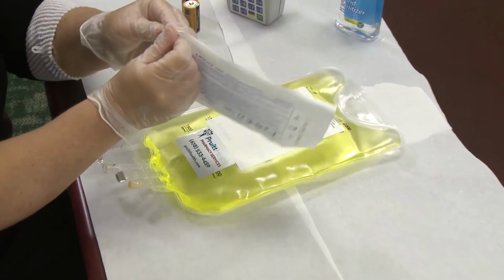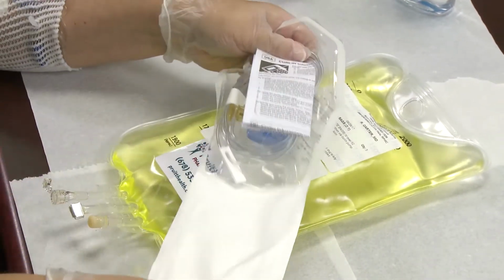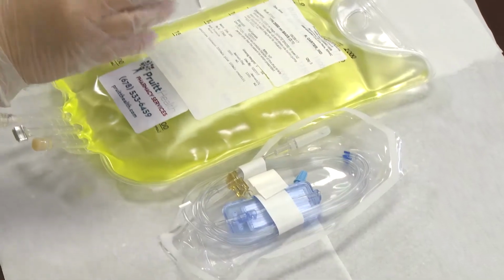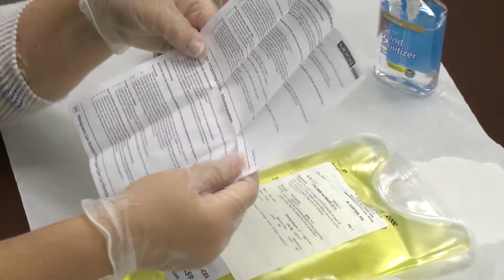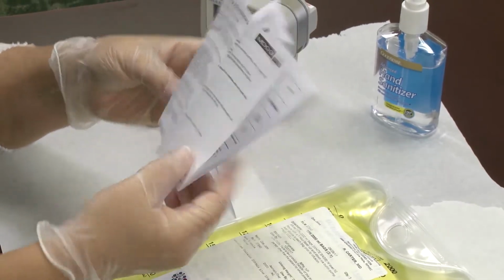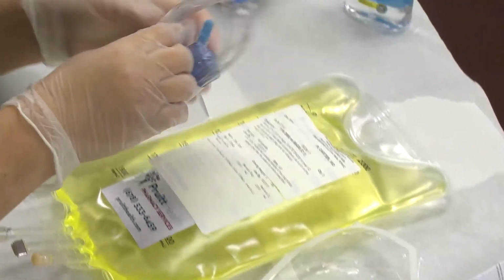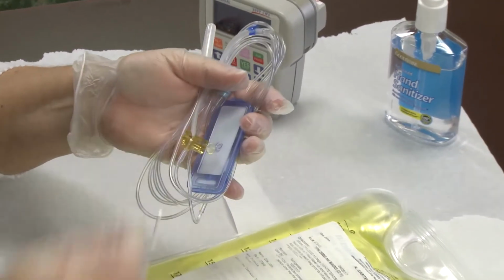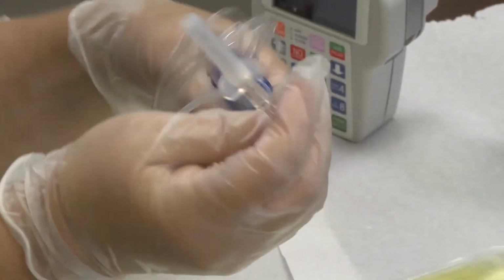Tubing comes in a bag. This is tubing that's specific and dedicated to the pump, and in this case it's the Curlin pump. It has instructions in here. If you have any questions about how to do this, there are instructions in many different languages right in here with the tubing. The tubing comes wrapped up with a paper tab on it that you need to break and take off and throw away. We're going to look at this tubing for a minute and talk about it.